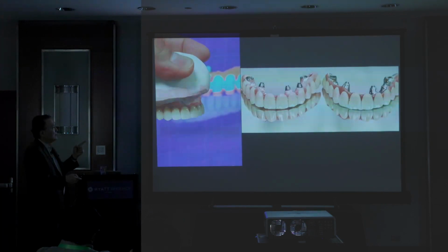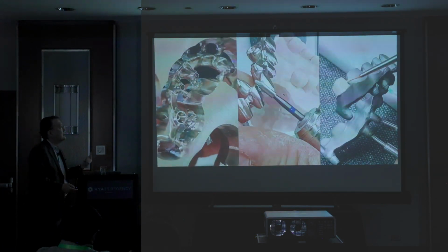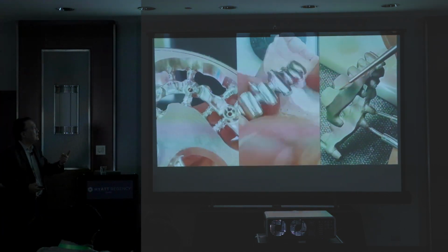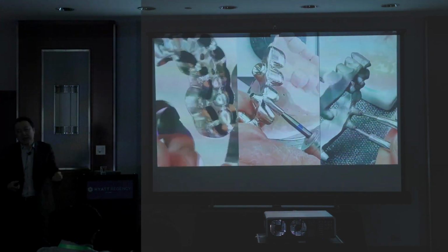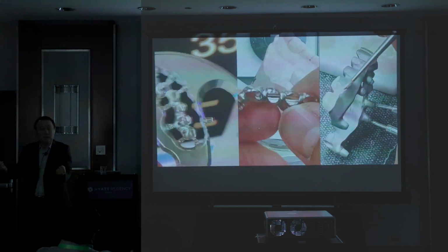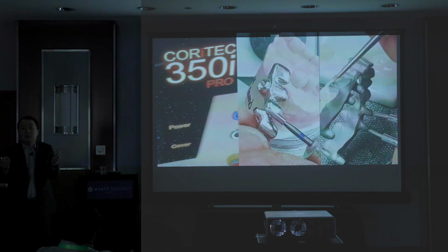That one, right? So after I got the metal, using the Datron D5, IMS Core, it's still not right, because the designer and the final contouring are different. Make sense? So we're selling the final product, right?